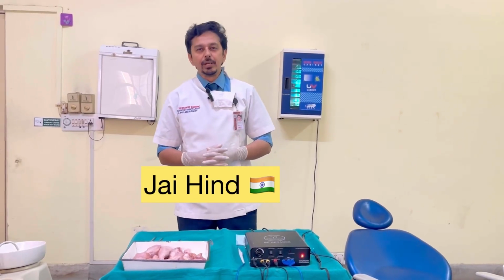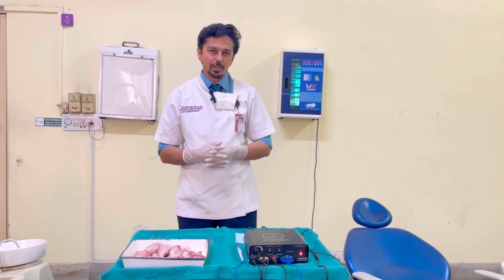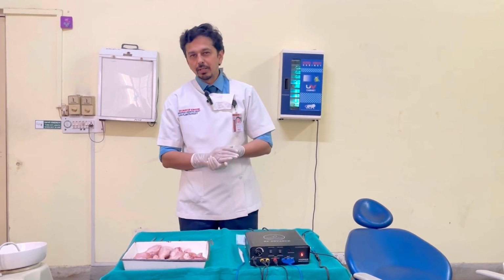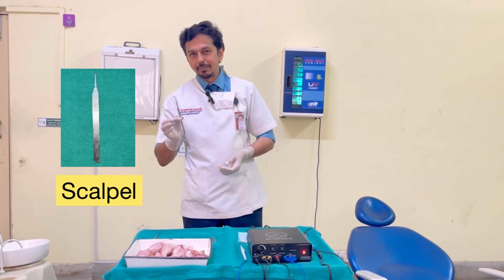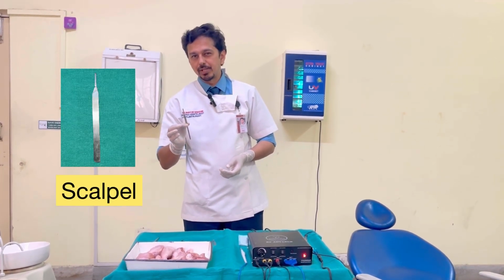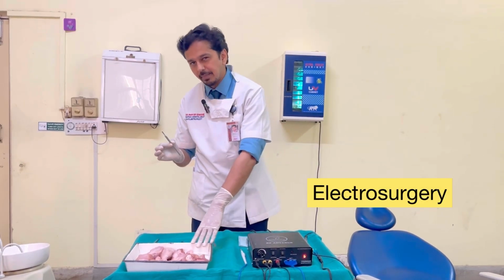Jai Hind. In continuation with the educational clinical videos of PERIO Subharti, today's short clinical video would be a comparison of conventional scalpel use for incision and excision versus that of electrosurgery on an animal model.